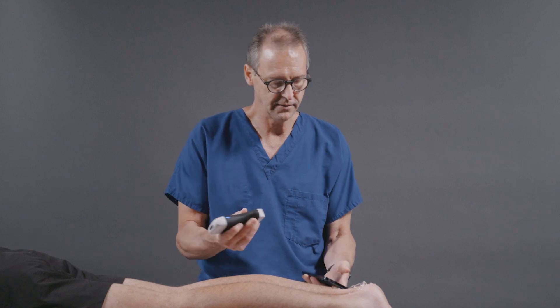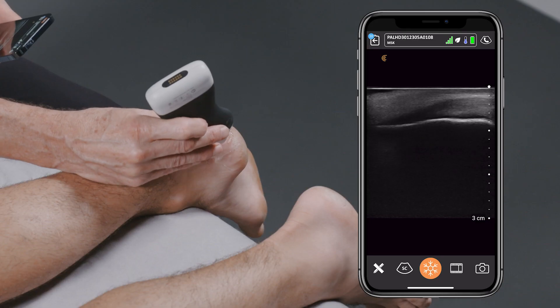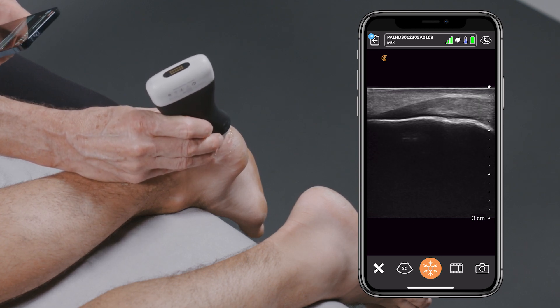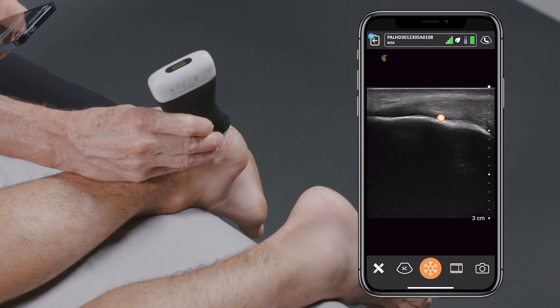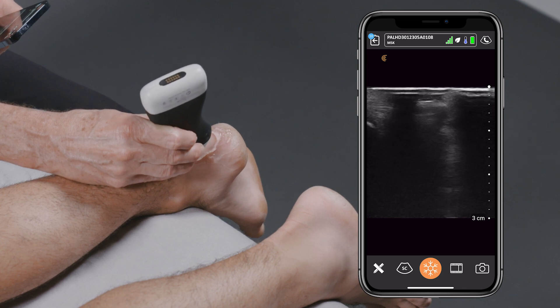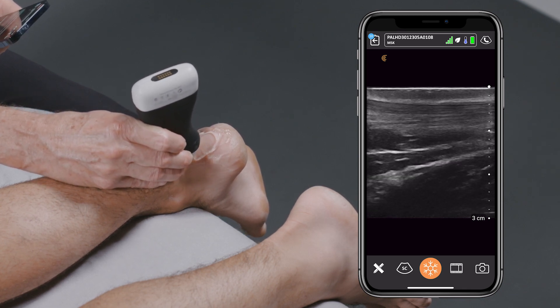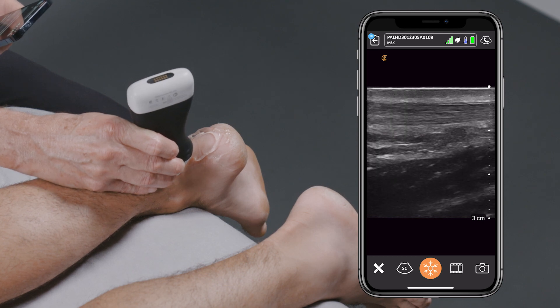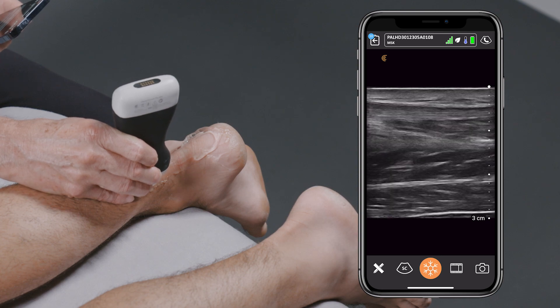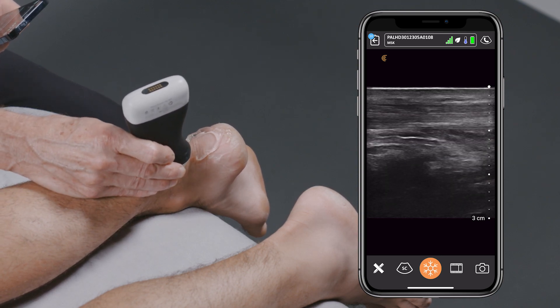Then go ahead and take the linear array transducer and place it down over the calcaneus. You'll look for where the tendon inserts onto the calcaneus, which you can see right here as it attaches down onto that bone. Then slide the transducer towards the knee, trying to keep that tendon in plane the entire way, until either you see that it inserts into the muscles of the calf, or you see evidence of a rupture or other type of tear.